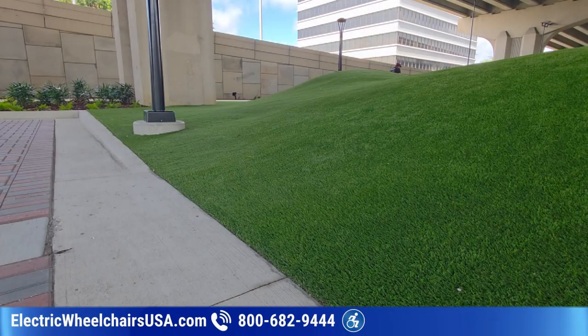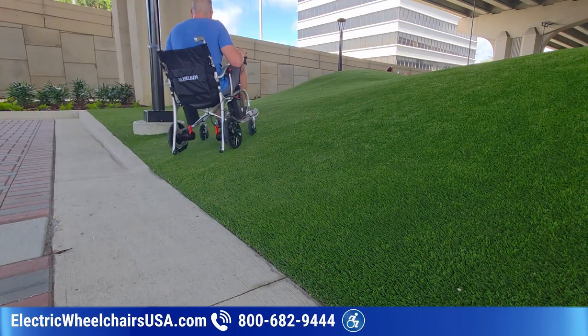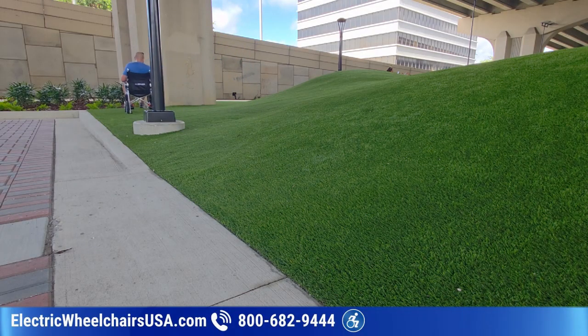All right, so you can see this is a pretty steep hill. Now again, if I go up this hill, I want to lean forward to be careful, and you can see it's definitely capable of climbing something like this, but you're not really going to ever climb a hill like this. I'm just trying to show you what's possible. So definitely don't try this at home. But the reason I'm really showing you this is because obviously if you have a steep ramp at your house or that you need to access something, the chair can easily go up pretty much any steep ramp that you might have for your home, or that you might see out and going into a business or something like that.